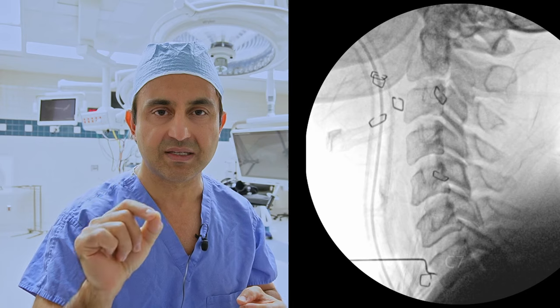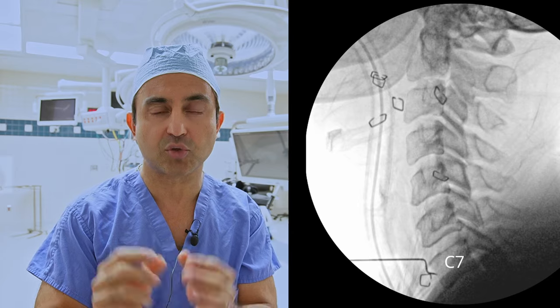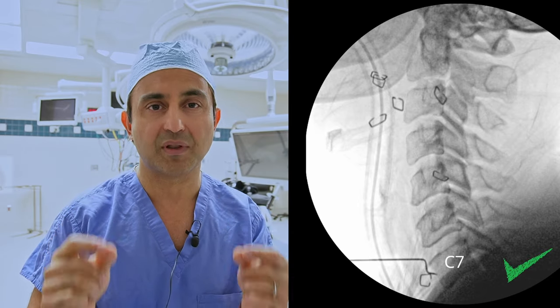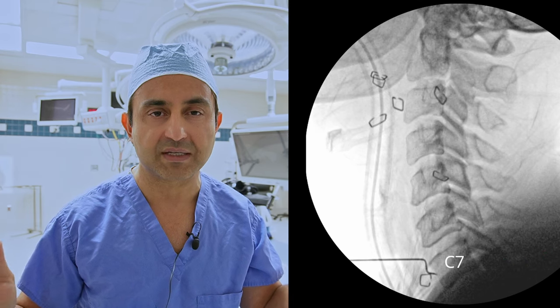After we figure out where the C6 and C7 vertebrae are, we make a small incision between those two points. We get down deeper on the spine and very carefully take a tiny needle and put it into the C7 vertebra and check another x-ray from the side. It's very important to make sure that you are at the correct vertebral level, because of course you don't want to remove the wrong level disc.